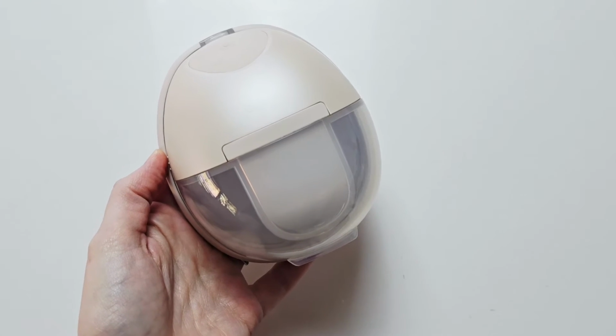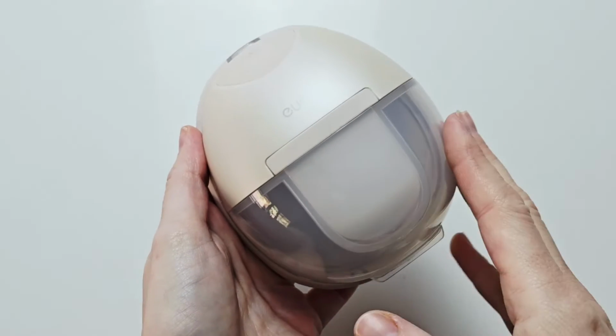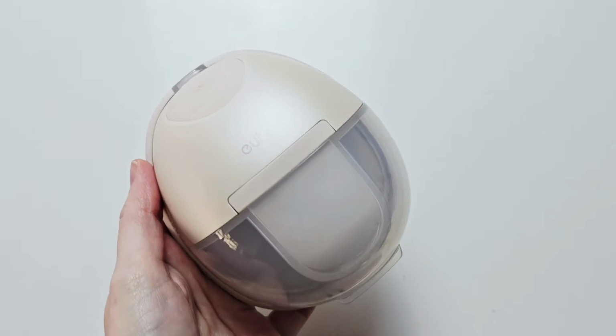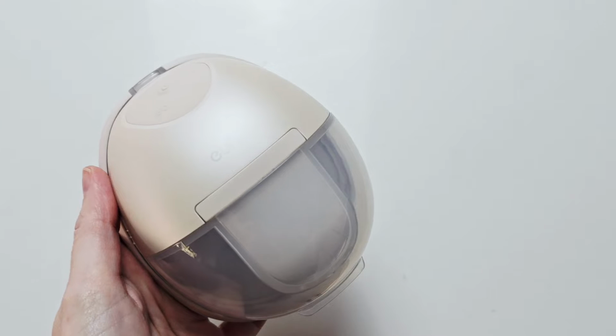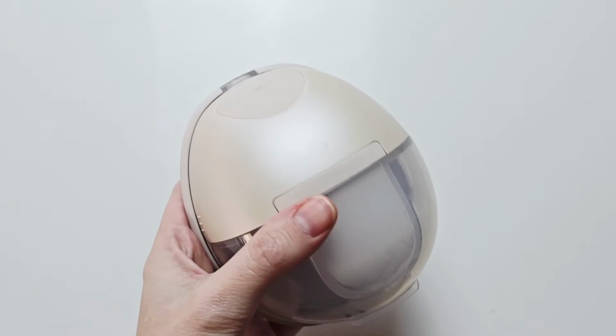Have you been wondering how often to replace Eufy S1 Pro breast pump parts? Then let me help. I'm going to walk you through the different parts of the Eufy S1 Pro and how often you should be changing them. So let's get started and take a look at some of the more common parts that need to be changed.